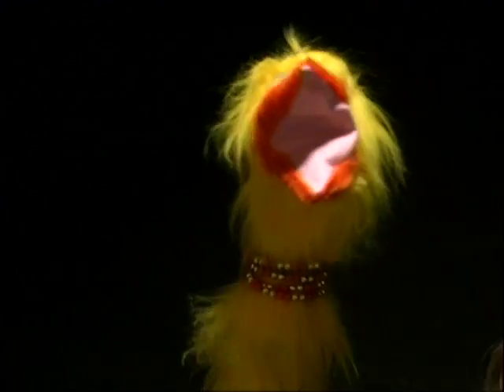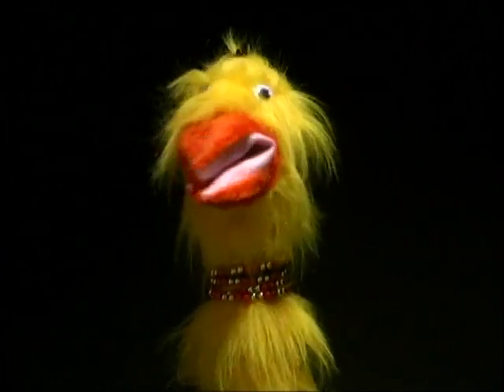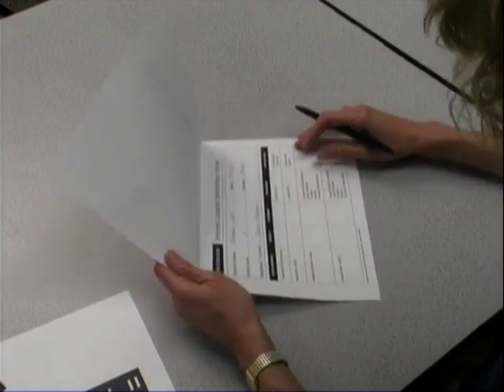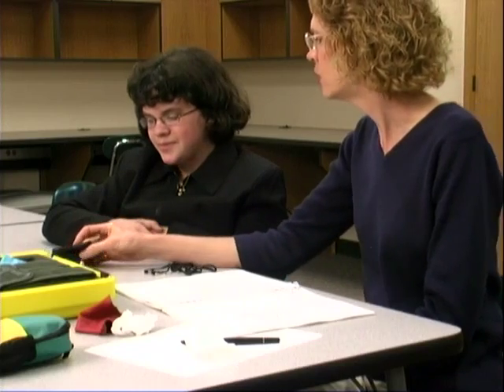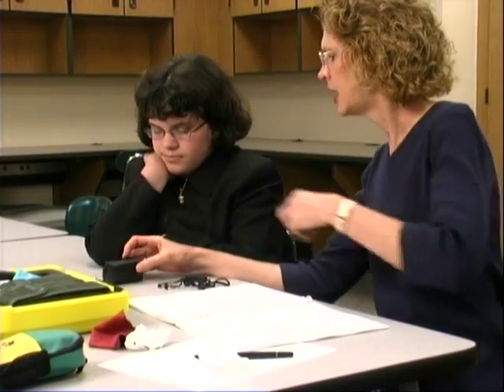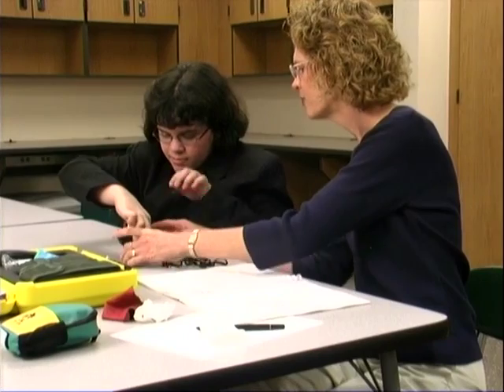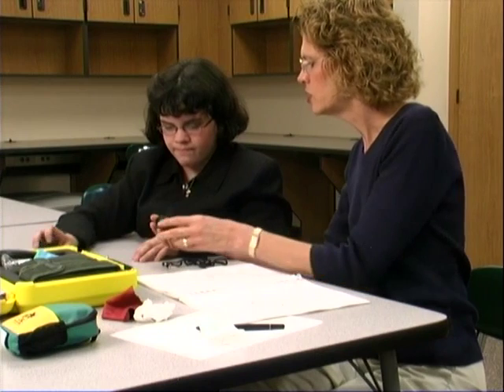There is only one Emmy, and that's me! Now that we've cleared that up, how do you get started with Envision? First, meet with your student and fill out the student information sheet. Remember to smile too. Once you're familiar with what your student needs, there are other things to find out — like, does your student know the parts of the telescope? Does she understand the concept of in focus? Does she know how to hold it? Watch as Ms. Strotman introduces the telescope to Daisy Lee.